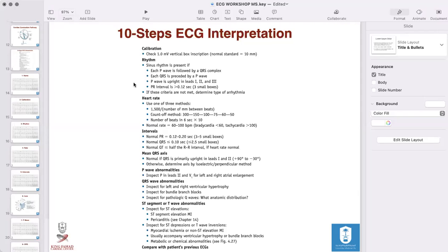Assalamu alaikum. Alaikum assalam wa rahmatullah. Doctor, I just have one question. Let's assume that we have a patient known to have myocardial infarction before, and I did a new ECG for him. How do we differentiate between the old changes and the new ones?